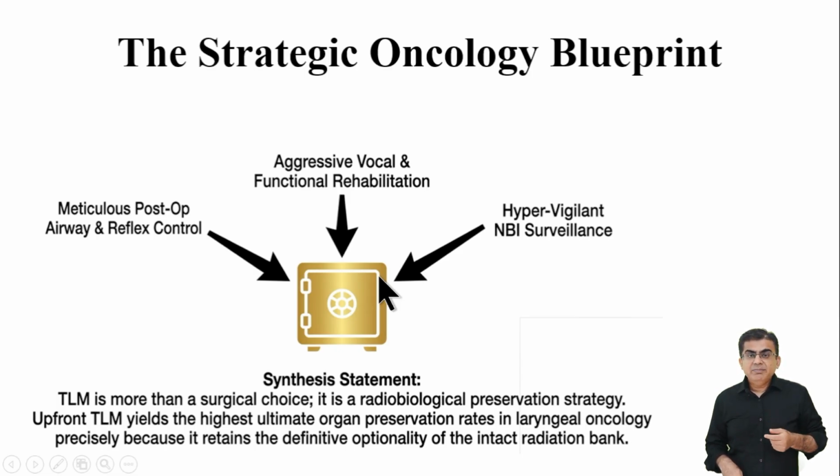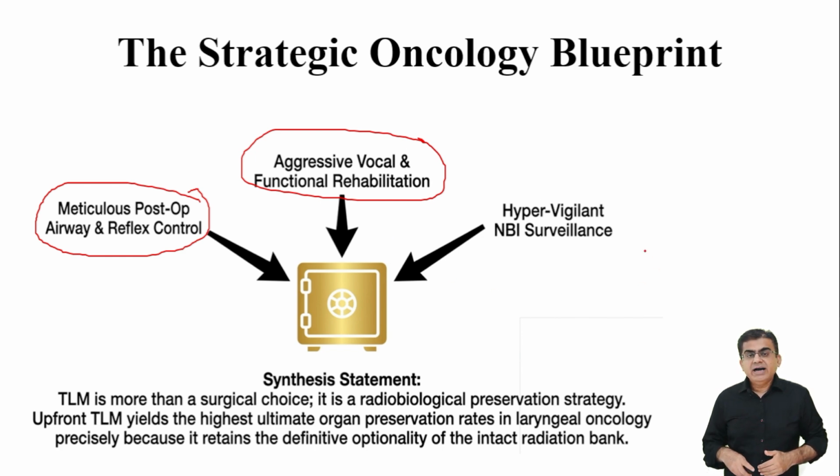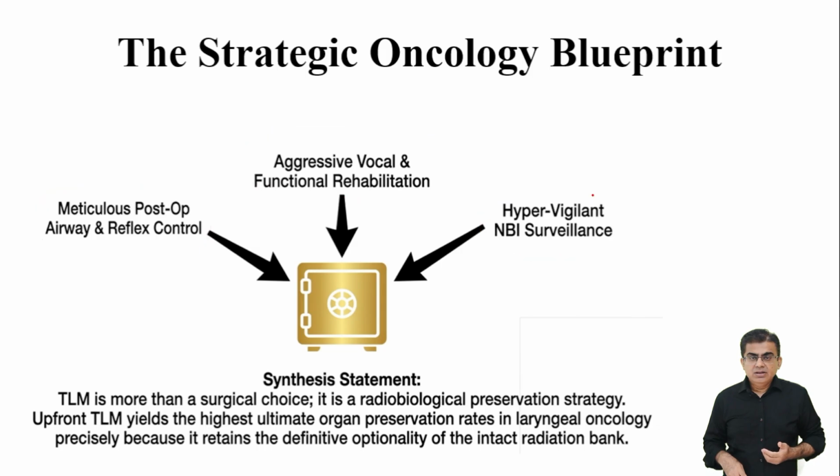First, you must have meticulous control over their airway and any chemical reflux after surgery. Second, you must provide aggressive voice and swallowing rehabilitation so they can function normally. Third, you must use hypervigilant narrowband imaging surveillance to safely catch any tiny recurrence early.